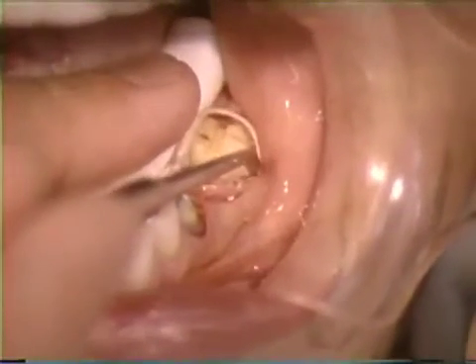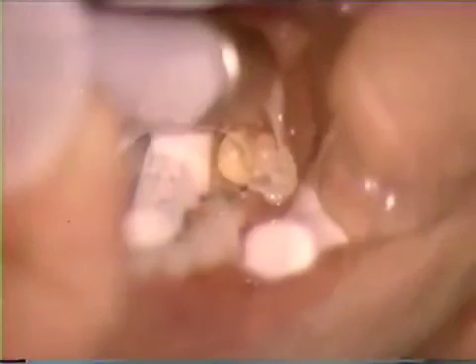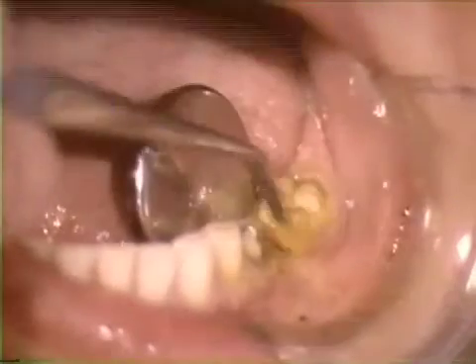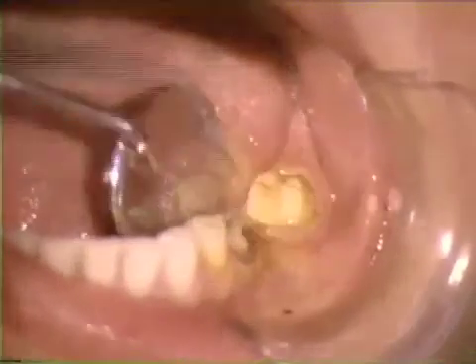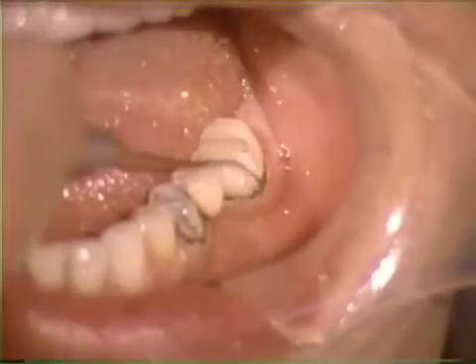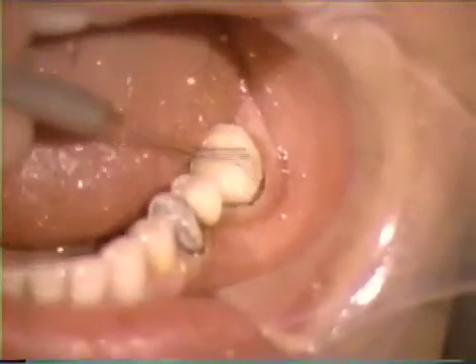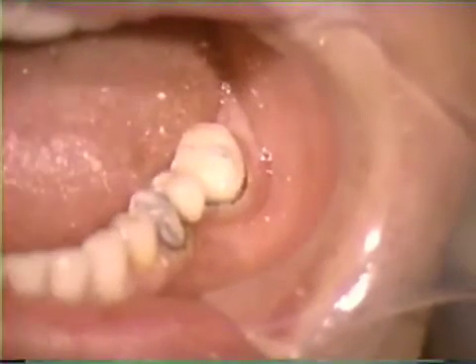With good access and visibility now provided, retraction cords and medicaments are placed and then removed at appropriate times prior to impression procedures. Tincture of myrrh and benzoin is painted over the surgerized tissue to provide increased post-operative comfort. Once the medicament has been applied, the provisional restorations are cemented with a suitable interim cement. The excess cement is removed and the patient is dismissed after having received post-operative care instructions, which include hot saltwater rinses during the first two days.